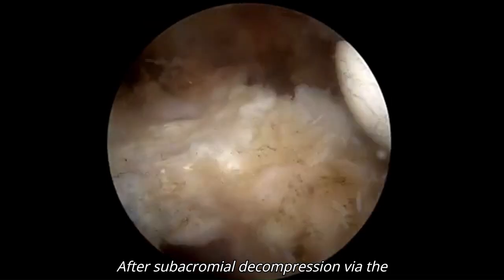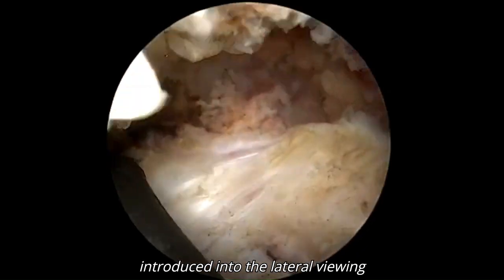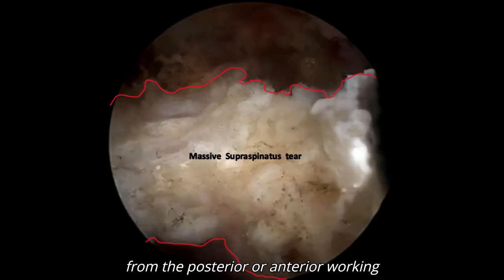After subacromial decompression via the posterior portal, the arthroscope is introduced into the lateral viewing portal, as well as further decompression and cuff tear definition is performed from the posterior or anterior working portal.